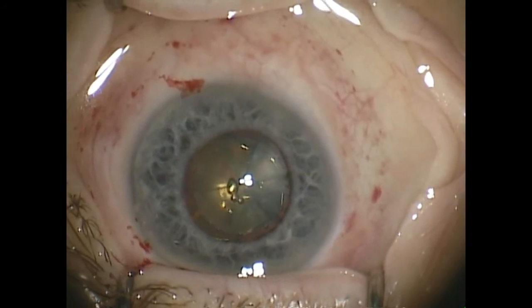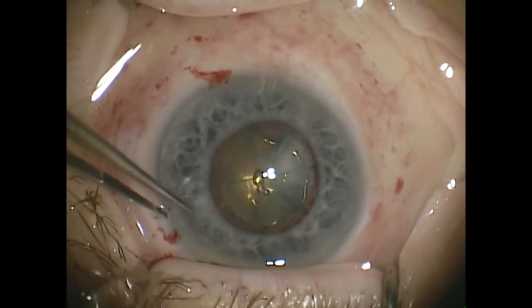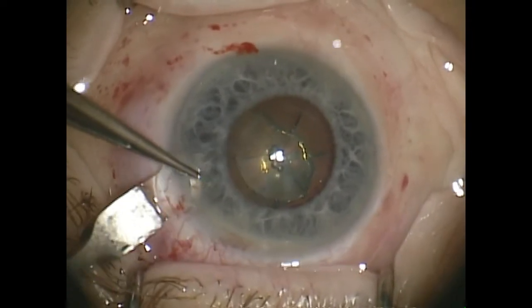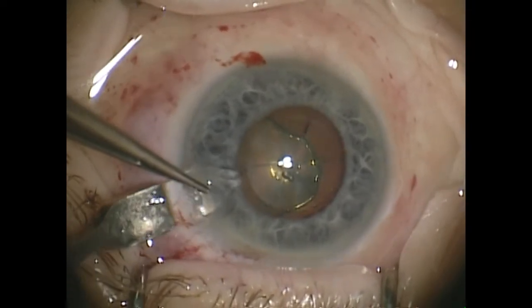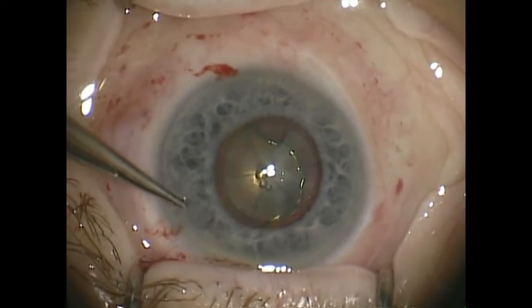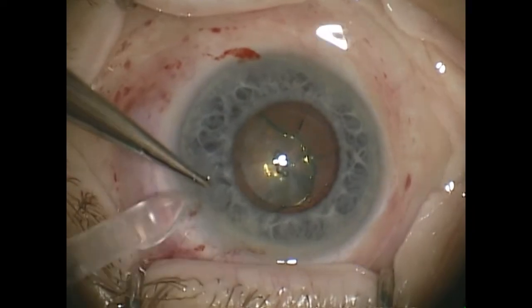So here we have a second case. This is an iris that's constricted down after femtosecond laser capsulotomy and segmentation of the nucleus. The inserter here is used.